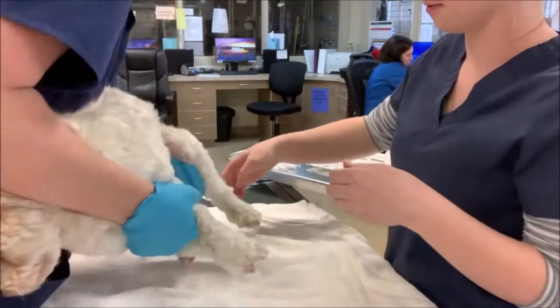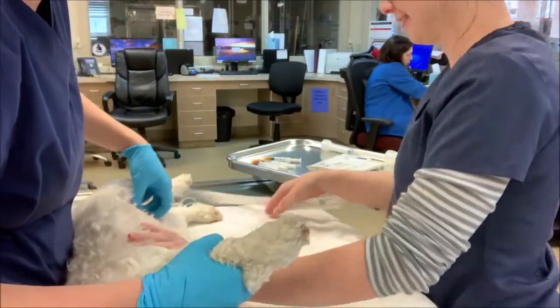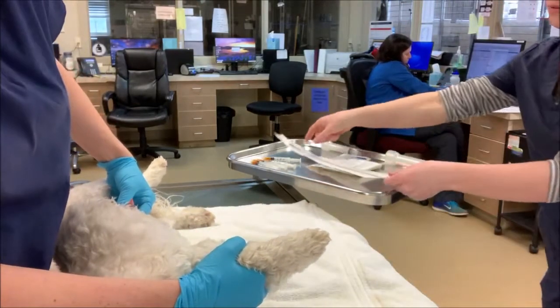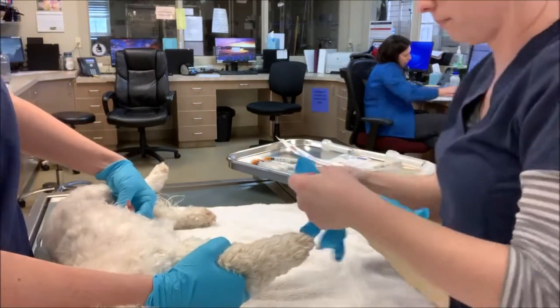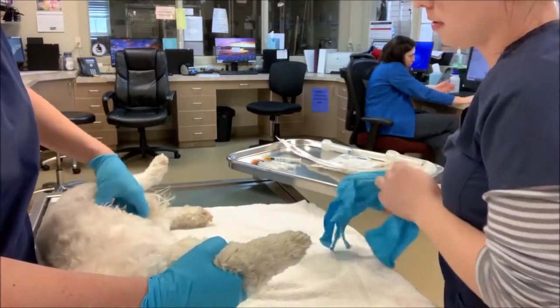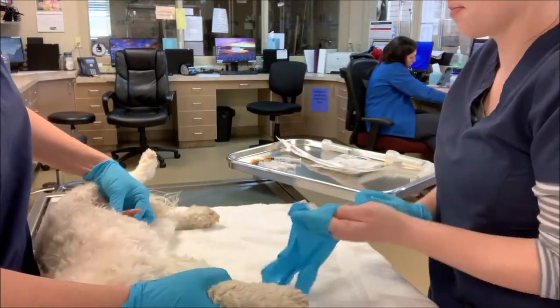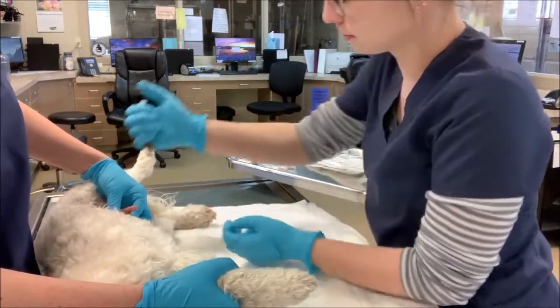I have my assistant put Carter in lateral recumbency and pull his prepuce back to expose his penis so I can flush the area. For this video I used 1 ml of diluted betadine five times, so a total of 5 ml's.